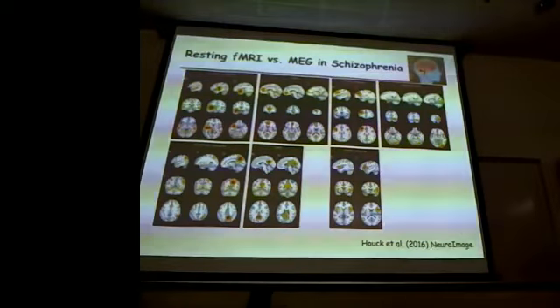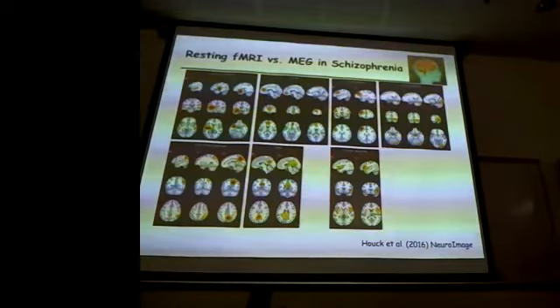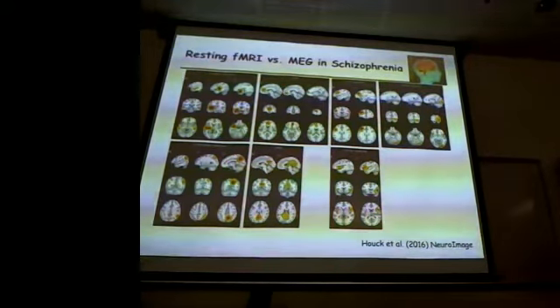But yeah, there are definitely things that MEG and EEG are less sensitive to because it's not a volume measurement. So things that are deeper are harder for us to see. Absolutely true. So we tend to stick with cortex rather than subcortex.